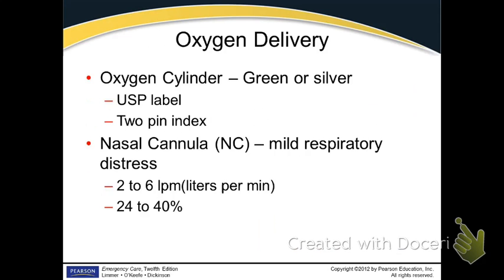Now we're going to learn about our first drug that we're going to administer. Oxygen, right? Oxygen is a drug. Not the oxygen that we breathe here, because room air oxygen is what percentage? 21%, right. You can have all the room air oxygen you want. This oxygen that comes in here is what percent? 100%, right. This is medical grade pure oxygen. It's 100% oxygen that comes out.